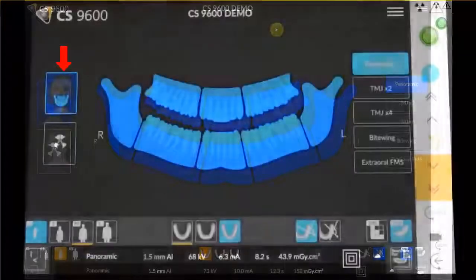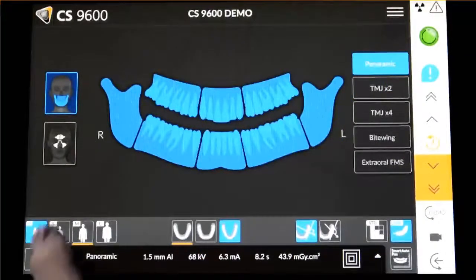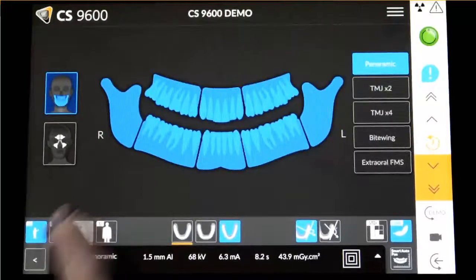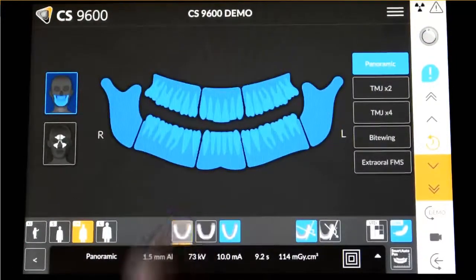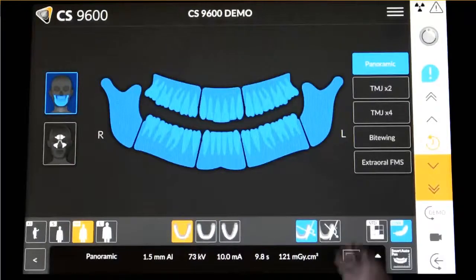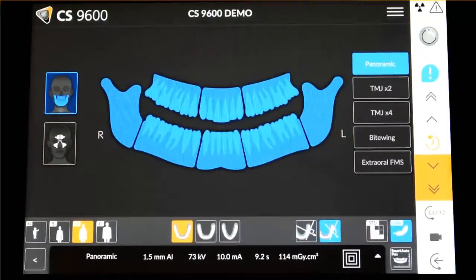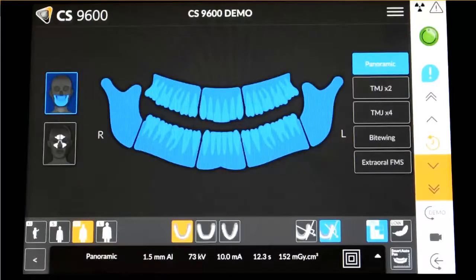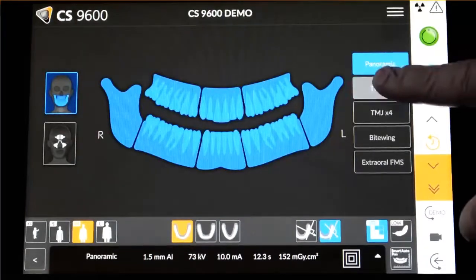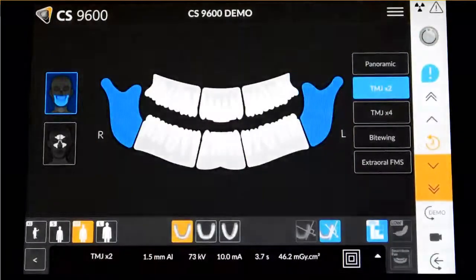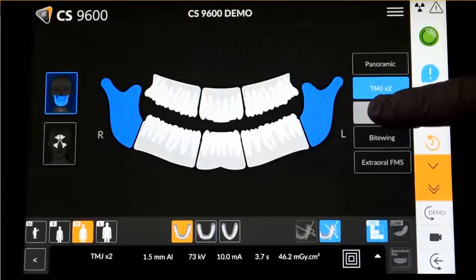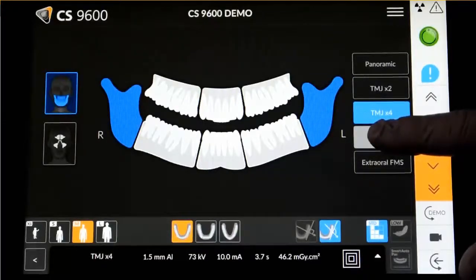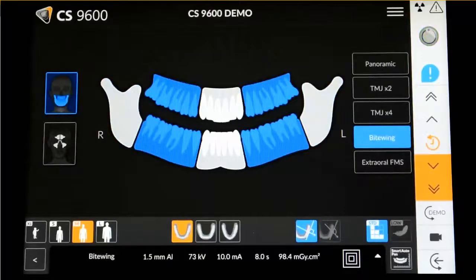Select Panoramic Acquisition. Select the patient type, Dental Arch morphology, Type of Trajectory — Standard or Orthogonal — and Imaging Mode — Standard or Low Dose. Select the Radiological Exam option: Panoramic, TMJ x2, TMJ x4, ByteWing, or Extraoral FMS.